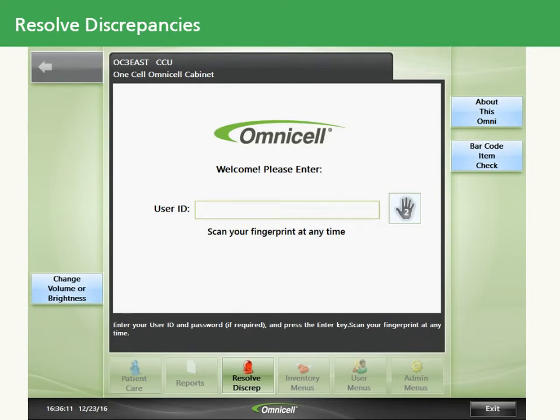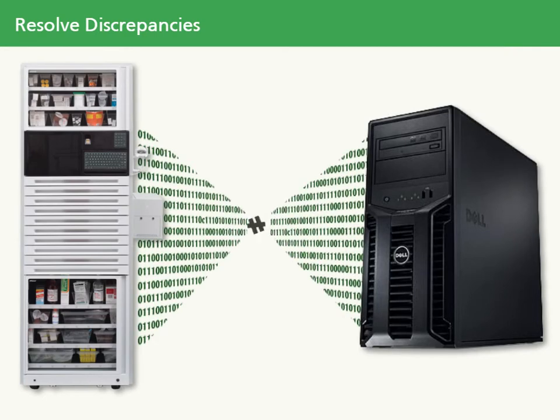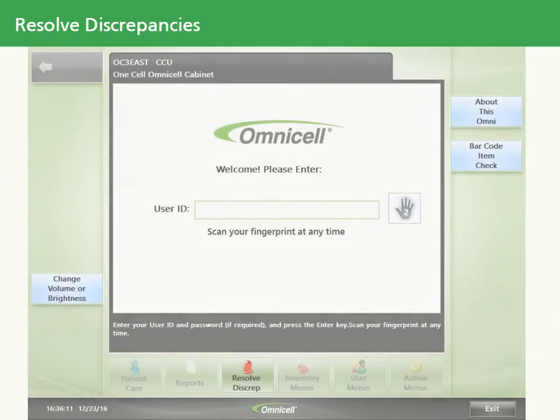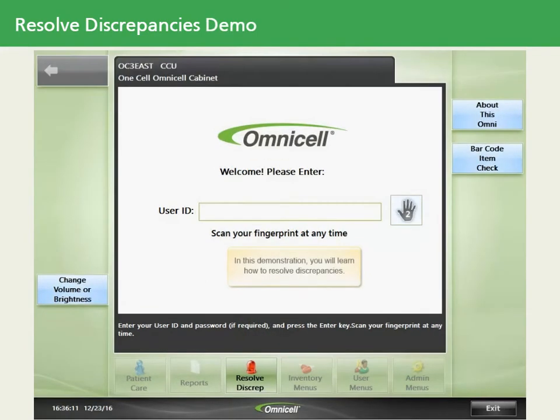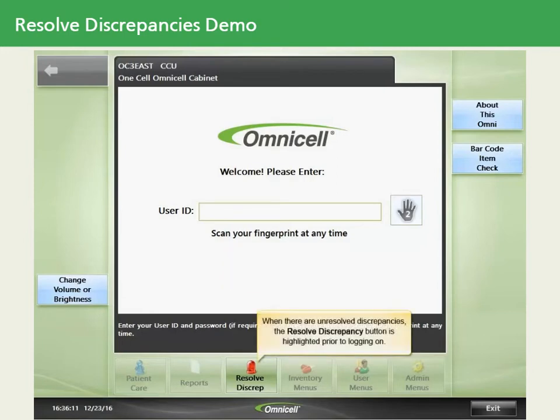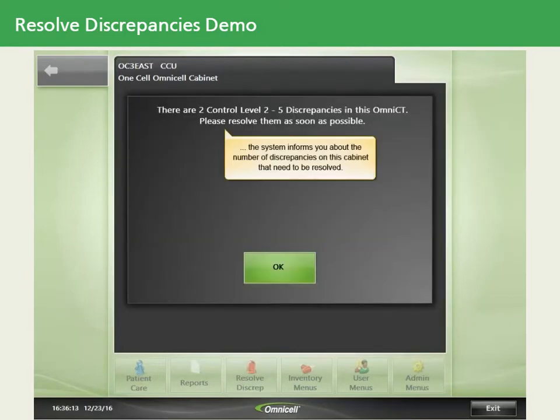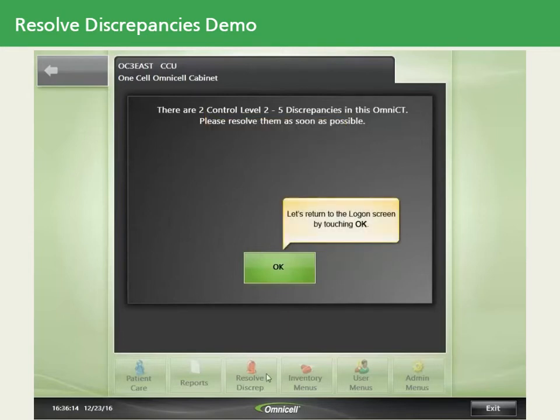It's very important to know what to do when discrepancies are created in the system. The Color Touch system considers a discrepancy to be the difference between the expected amount of an item stocked in the cabinet and the actual amount. When an item is accessed and the quantity in the bin differs from what the system expects, a discrepancy is created. This can be triggered during issue, return, or a cycle count. If discrepancies exist on the cabinet, the Resolve Discrepancy button remains highlighted even when no one is logged onto the system. In this demonstration, you'll learn how to resolve discrepancies. When there are unresolved discrepancies, the system informs you of the number of discrepancies that need to be resolved — in our case, two. Let's return to the logon screen by touching OK.